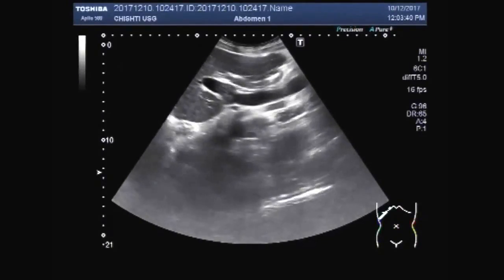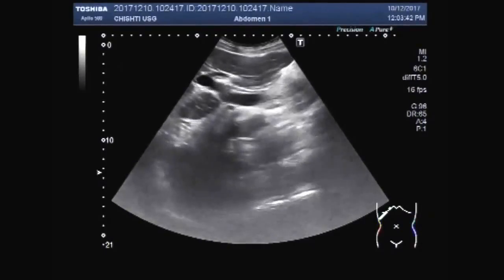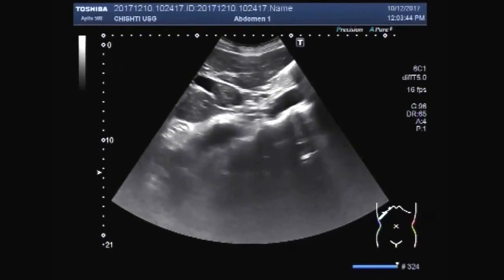Now you can see the portal vein, and this is the thrombus seen in the portal vein.